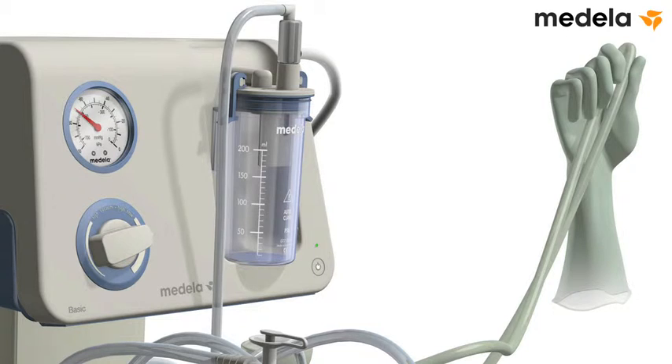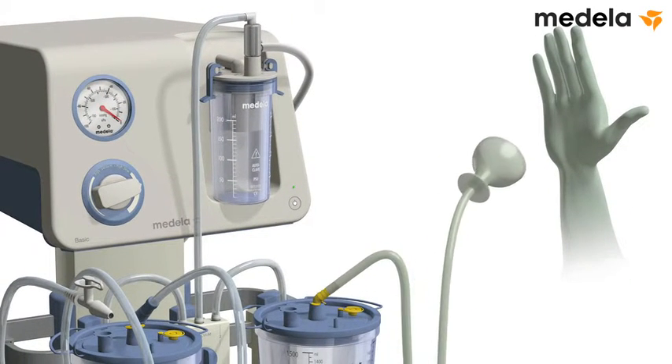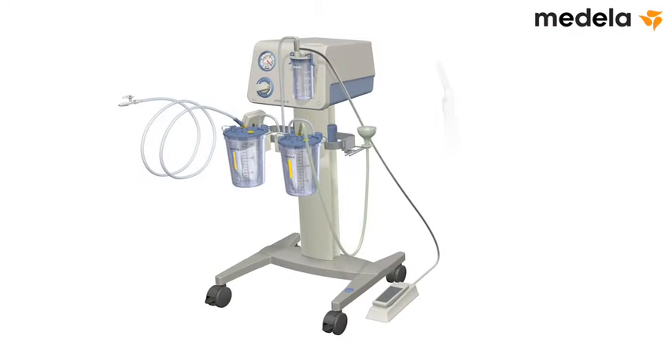When the vacuum gauge shows that the vacuum is stable at the set level, release the tubing. Test the vacuum against your sterile gloved hand. Return the foot controlled vacuum regulator to its resting zero pressure state by pressing the back part down using the heel of your foot. The equipment is now ready for use in the vacuum assisted delivery procedure.